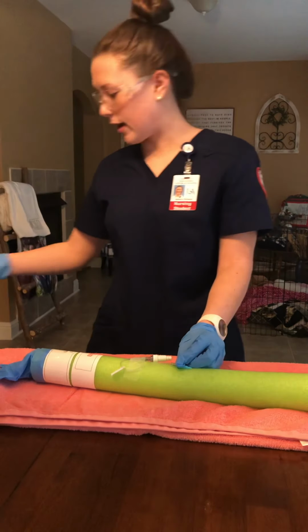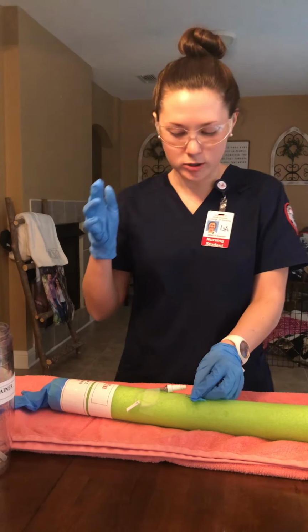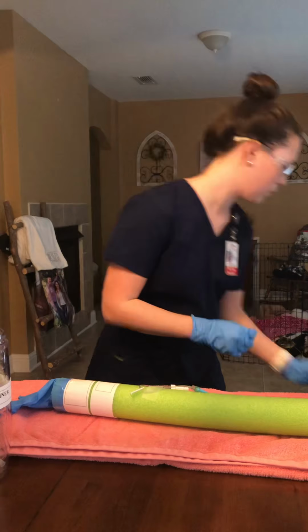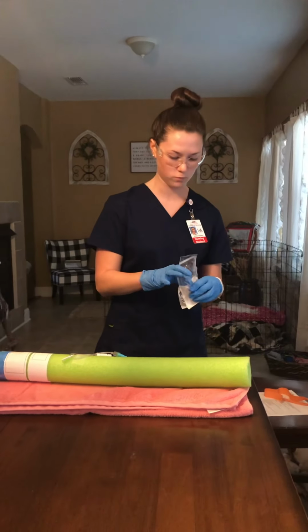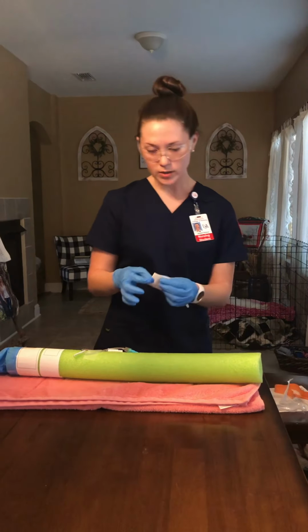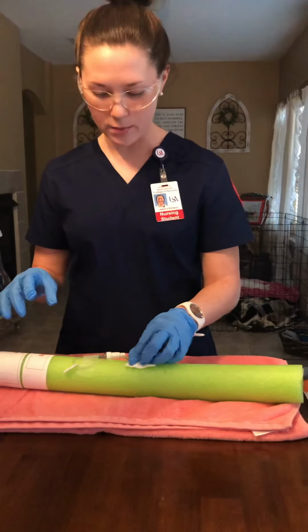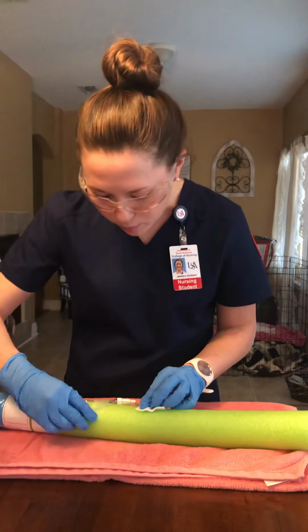Okay, and once I get that done, I'm going to dispose of that. And then I'm going to want to get a sterile gauze. So this would be on a bedside table, and it would be sterile. So now I'd want to put this over the injection site. So now I want to remove the tape.